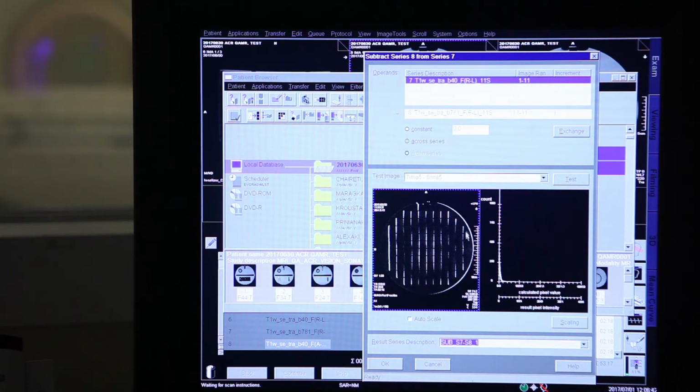Also important here, you see that this shift is changing somewhere here. This means the shift is bigger there. You expect that the homogeneity in the center should be better than the homogeneity on the edges, right? So here the subtraction does not give anything important. You don't see shifts on this axis.